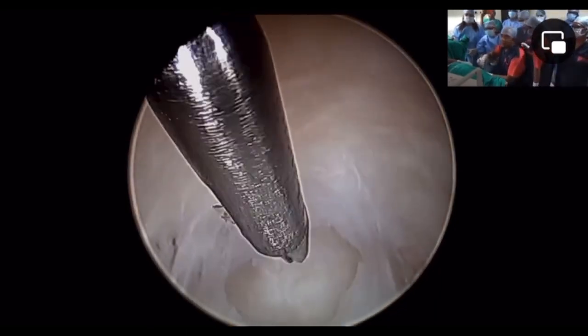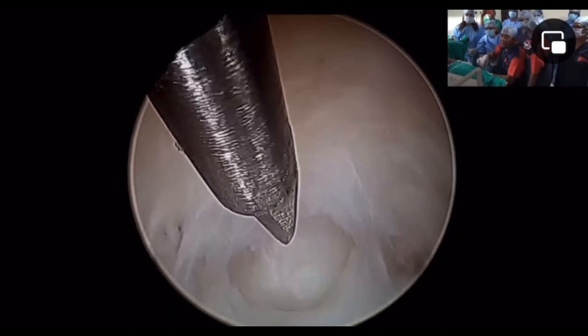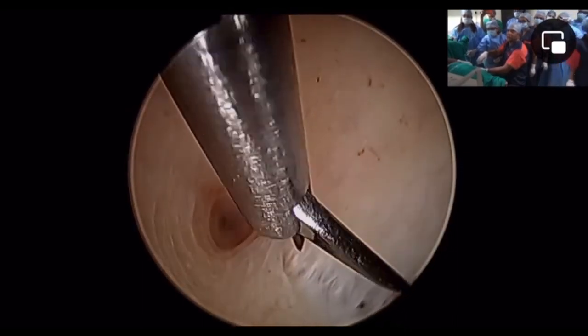So hysteroscopy is an art. It's not only to cut, it's not only to resect, it's not only to study fluid pressure, electrocautery, and so on. No, there are so many hidden details, and the secret is really in the details. That will make the difference between a performance with art, an ordinary performance, or failure of the performance.